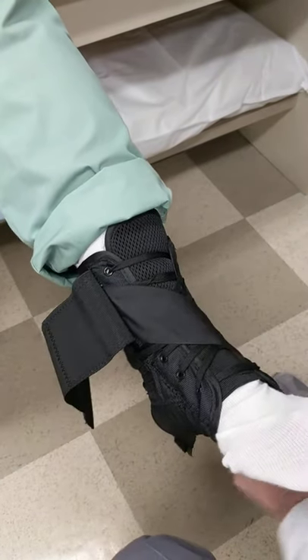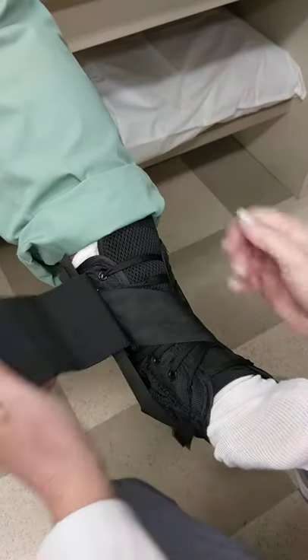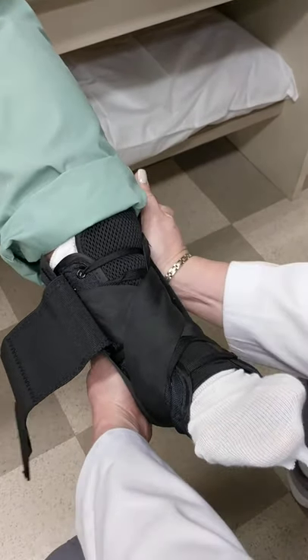Grab a strap, cross the front, underneath, up to itself. Grab the other strap, cross the front, underneath, up to itself.